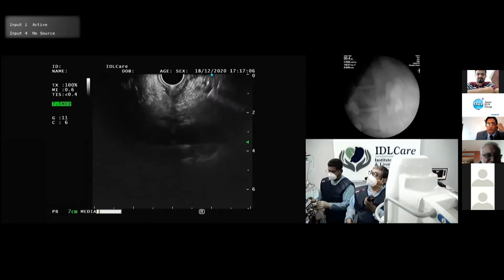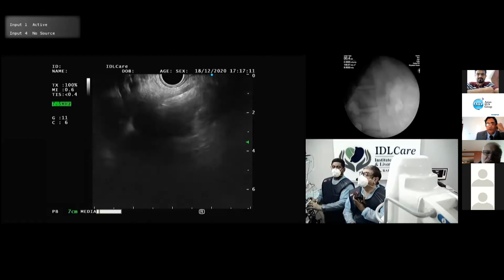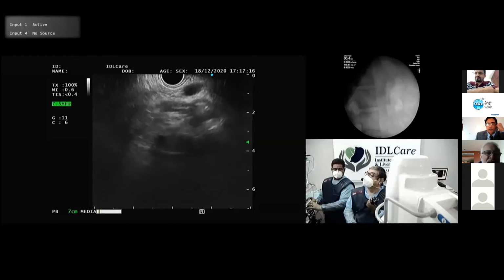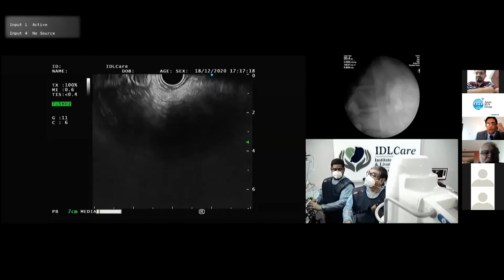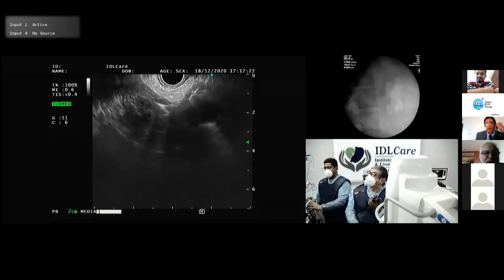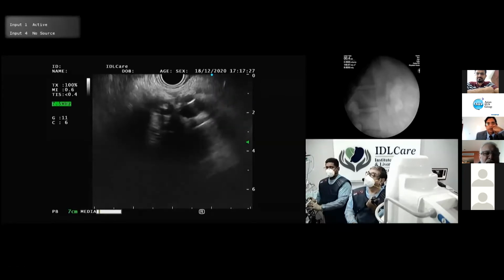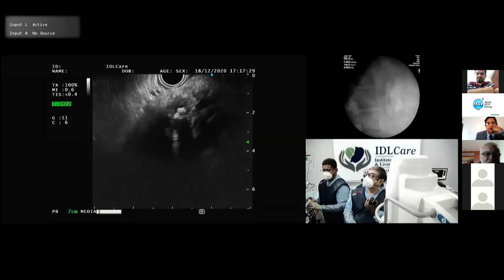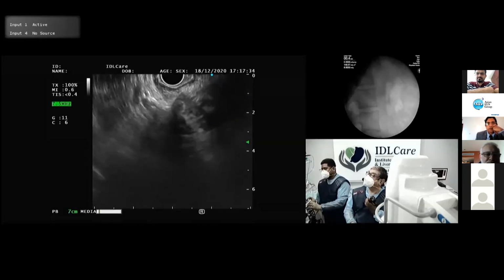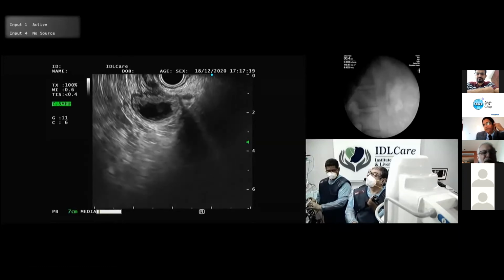But I'm a very conservative person. I'm thinking whether we should send her straight for surgery. Unfortunately, in my experience, these pancreatic duct strictures are very nasty, and even with multiple simultaneously placed stents, and after giving them ample time and removing them, these strictures tend to recur, and patients ultimately require surgery. So, what is the opinion of the house? Should I try puncturing or should I leave it? I mean, you're there, might as well.